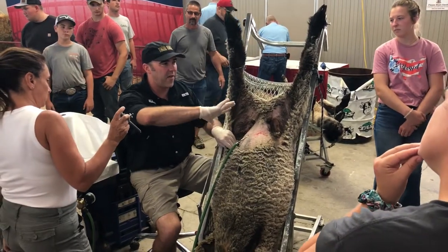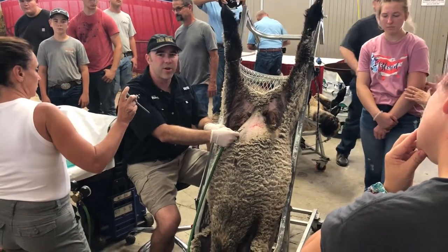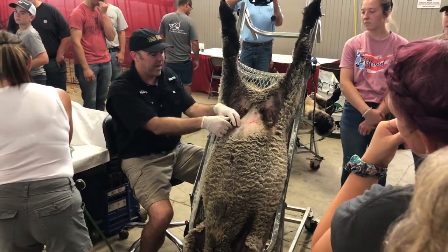Now the guts and stuff are moving away from the reproductive tract, so that when I stab the trocar in there, I don't stab any guts. So that looks kind of sharp — it goes in the spot where I made my incision.